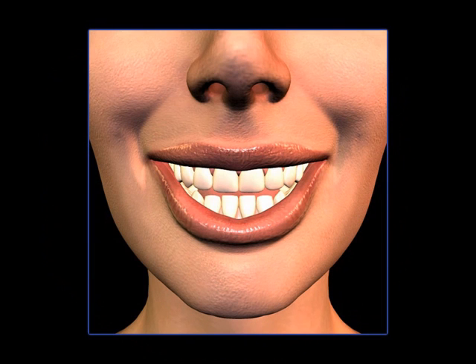A fixed bridge can be an excellent way to replace missing teeth, both from the standpoint of the way it can feel like teeth and because it looks like teeth.